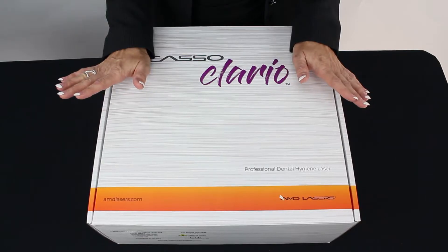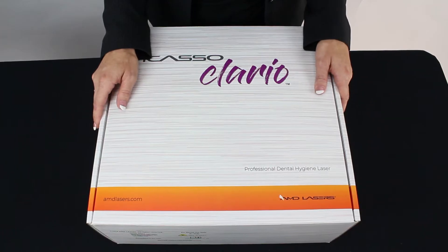Hello, my name is Tammy, and I'm really excited about this. We are doing the unboxing of the first diode laser made for dental hygienists, the Picasso Clario.